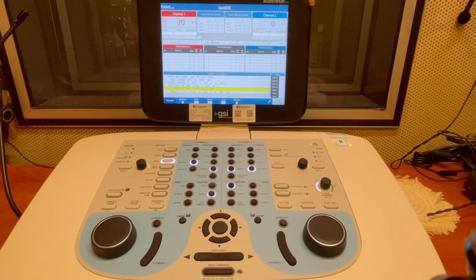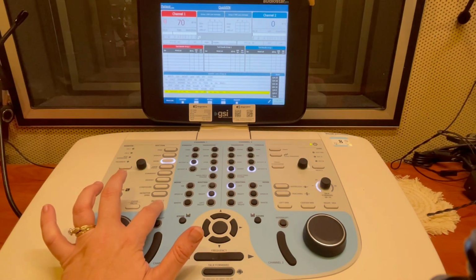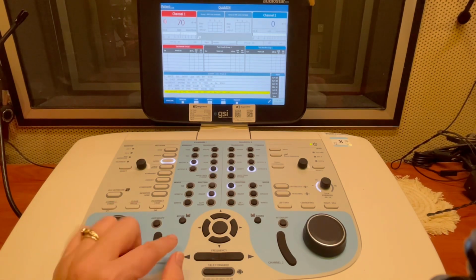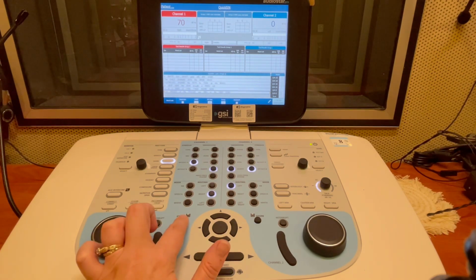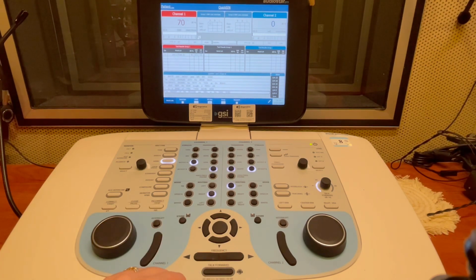And so we'll say that they missed a couple words here. And then we'll say that they missed all 5 words here. So we hit incorrect 5 times. So it gives us that sum. Once it's done playing, I'm going to hit score. And so we've got that value there, that value there. They got 4.5. We would do our second list. And then click the sentence.